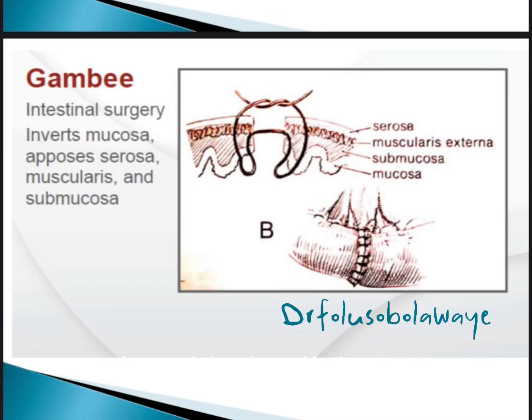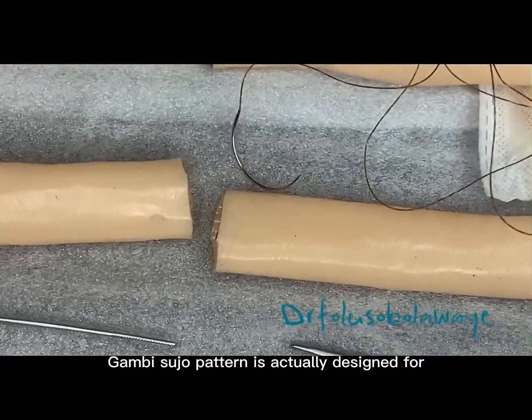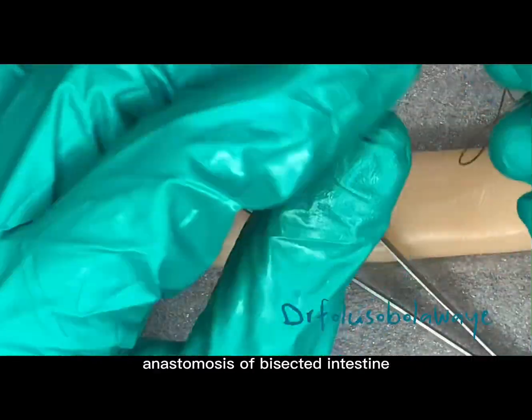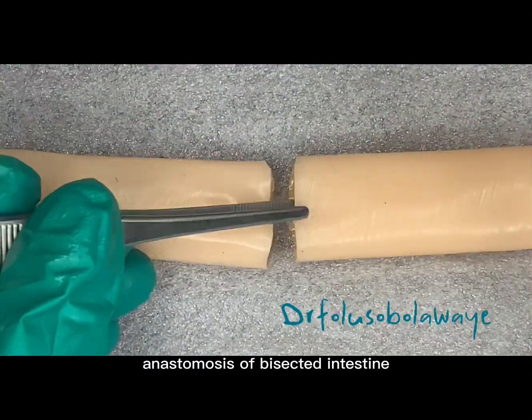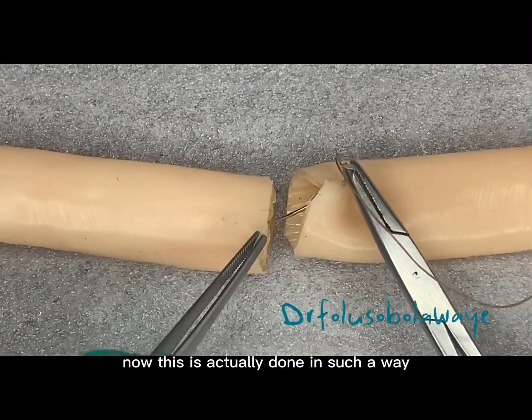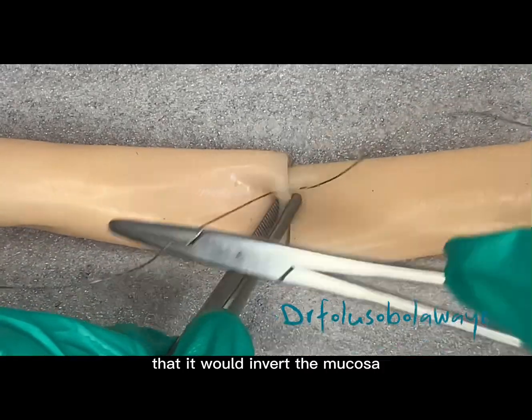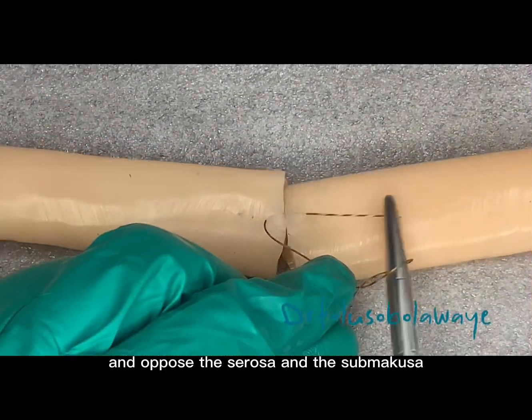Let's make the Gambee suture pattern. The Gambee suture pattern is designed for anastomosis of resected intestine. It is done in such a way that it would invert the mucosa and oppose the serosa and the submucosa.